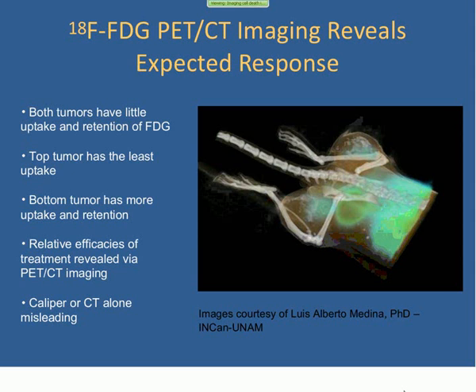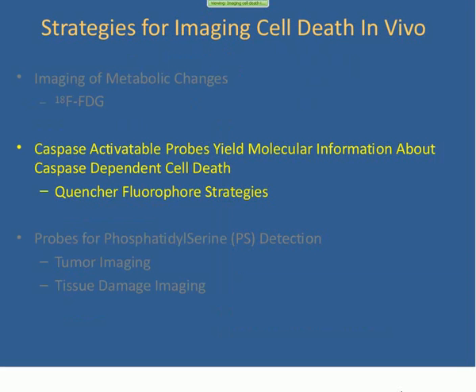So here's the animal in the CT modality, and this shows you each tumor that was irradiated. When you use traditional measurements, like using a caliper through the skin or using a CT to look at tumor volume, we saw no noticeable change in the size of these tumors after irradiation.